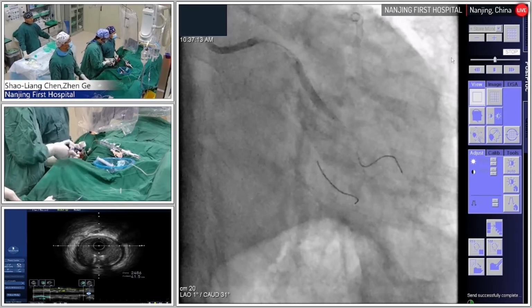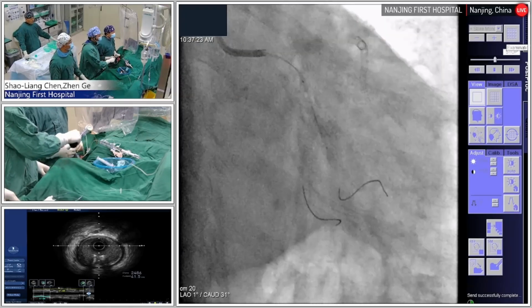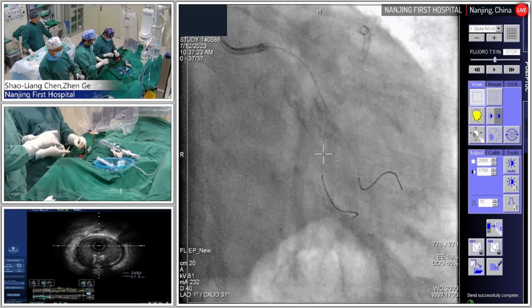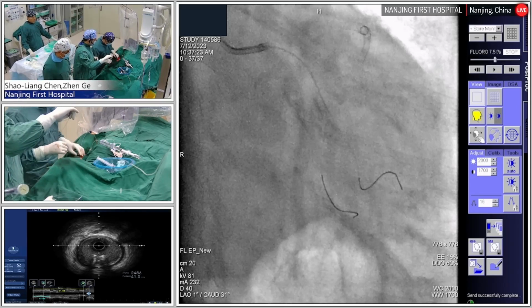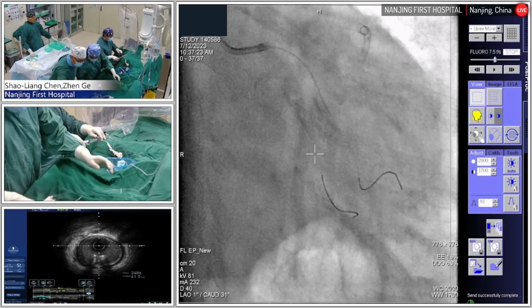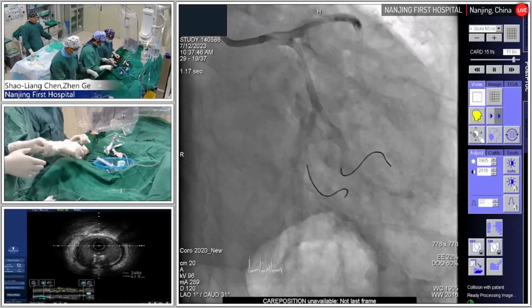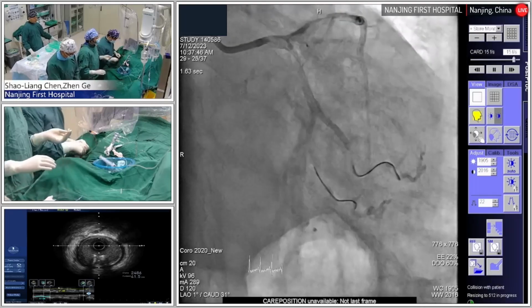So the 3.5 Firehawk stent easily gets a final diameter greater than 4.5, no problem. Particularly for a distal left main bifurcation lesion, if we use the 3.5 Firehawk from proximal LAD to left main, then after using one more 4.0 or 4.5 NC balloon we get a final diameter greater than 4.5. The important thing is the very low rate of stent fracture for the Firehawk stent when shifting from small diameter to large size.